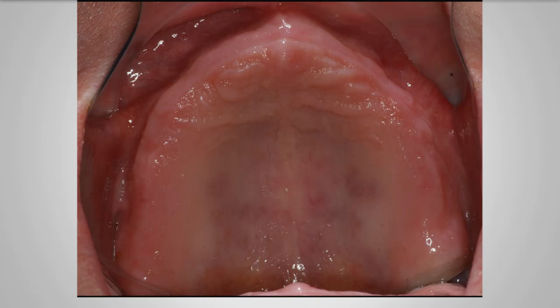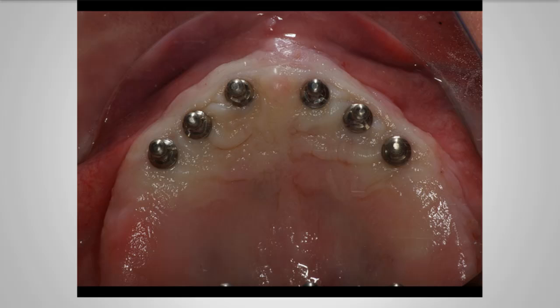Retrofitting an existing denture with small diameter implants. Here we had a patient present complaining of a non-retentive denture, and when he did use glue, he found that it was causing him to gag because of the posterior palatal seal. We take a look at the maxillary ridge and we notice that it is not very retentive. However, there was enough bone buccolingually to place small diameter implants.